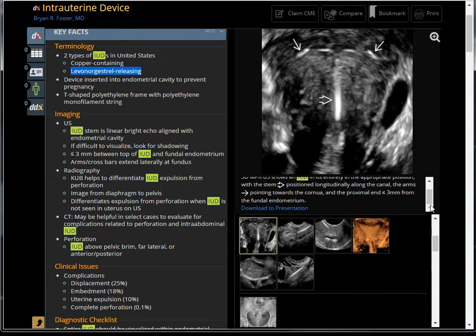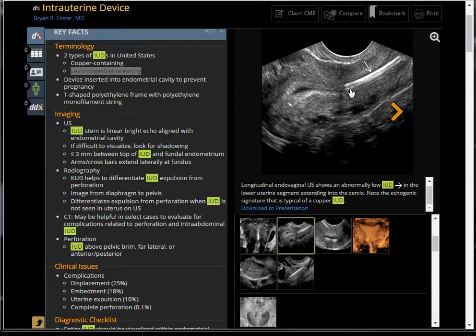The proximal end should be less than three millimeters from the fundal endometrium. Basically, the T-shaped device has to be close to the distal tip of the uterus. This one here is way too inferiorly located — the distal tip should be near the fundus. This is the sagittal view showing an abnormally low IUD device.